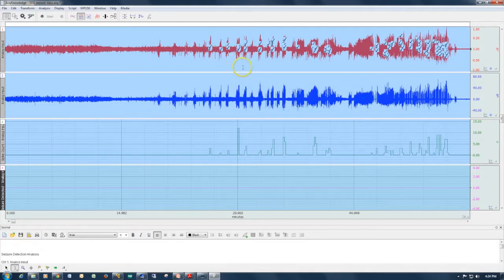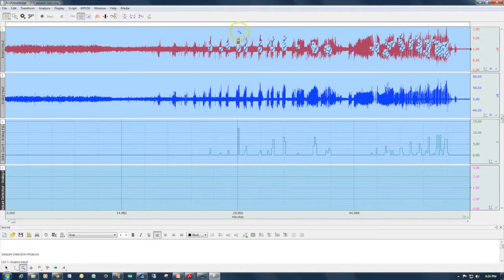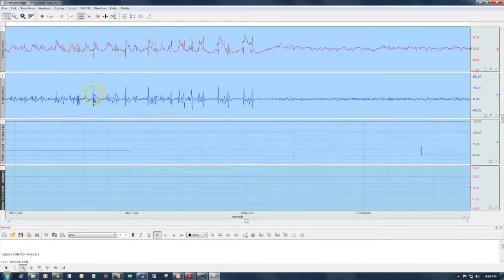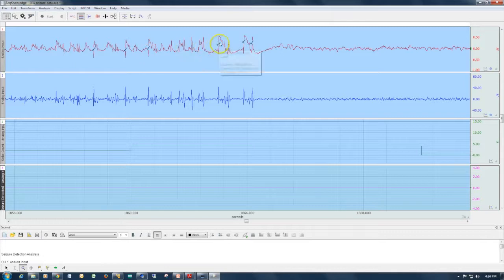The software has gone through and placed an event mark to identify each of the spikes that met our detection criteria. This particular spike crossed our threshold of 40, as did this one, this one, this one, this one, and so on and so forth.